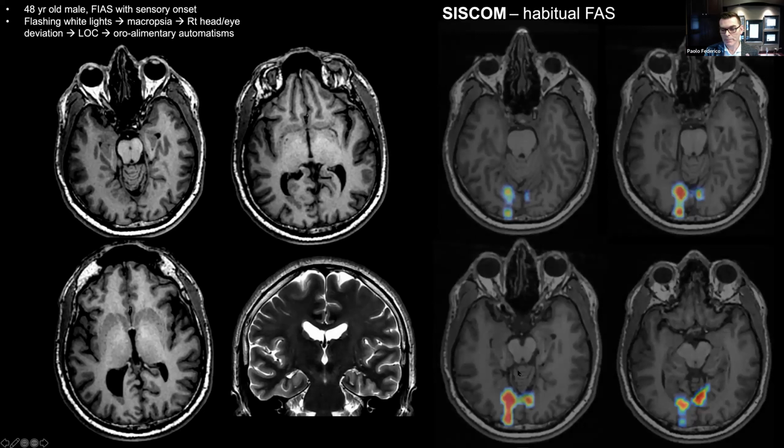Very focal hyperperfusion over what I think is probably back, unfortunately for him, the mesial occipital lobe here, and possibly involving the malformation of cortical development. So this information is very useful, and he's going to undergo intracranial EEG monitoring with the hope that we can maybe find something surgically treatable, although we suspect it won't be the case. But this is a very good example of how ictal SPECT can help identify the seizure onset zone preoperatively.